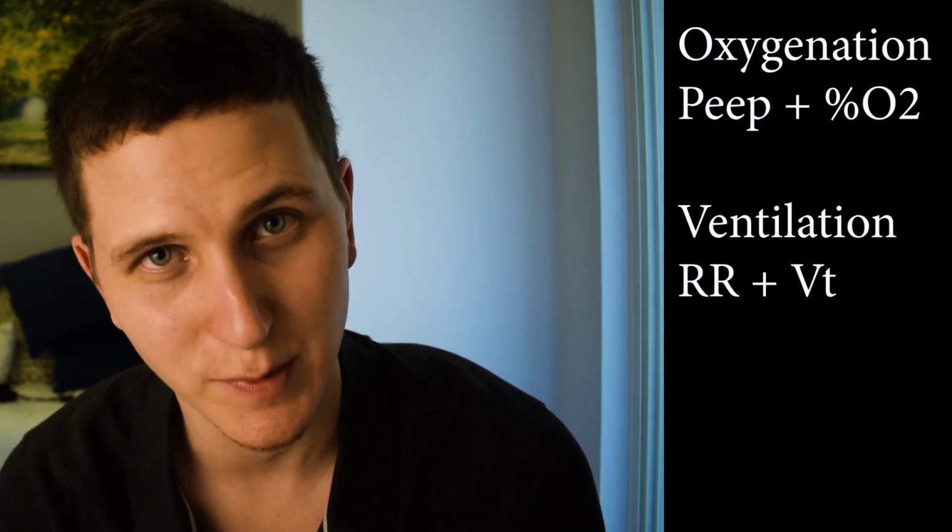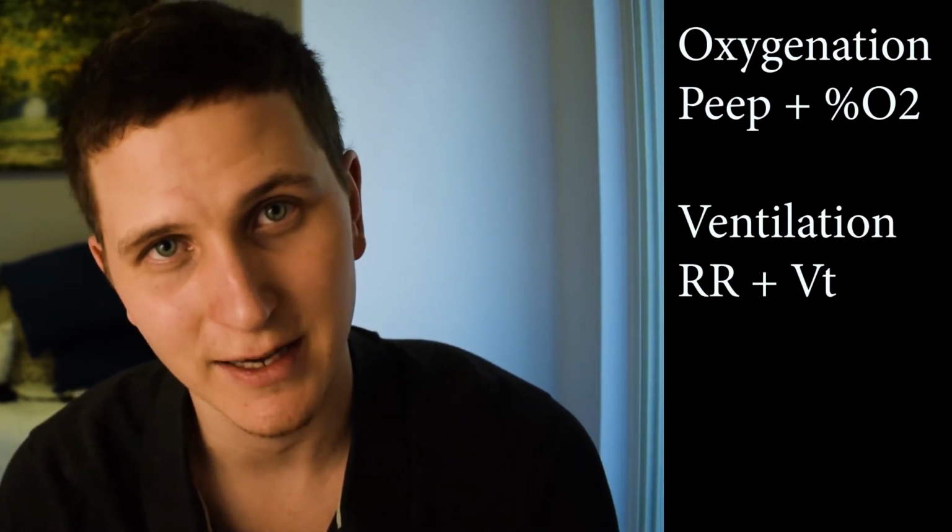The two settings on a ventilator that affect oxygenation are PEEP and your percent of oxygen, or your FiO2. The settings that affect ventilation are your minute volume, which is how fast you're breathing and how much air you're breathing. If you make me breathe faster and you don't give me more percent oxygen, I won't get more oxygen. I actually just blow off more carbon dioxide. So it's important to realize that only the PEEP, the positive end expiratory pressure, and your percent of oxygen affect your oxygenation, whereas your tidal volume and your rate of breathing affect your ventilation.